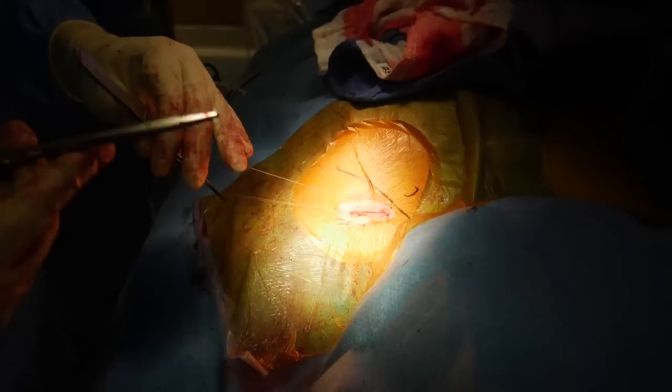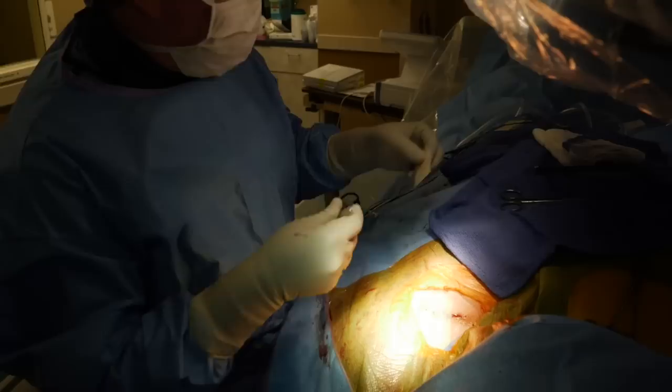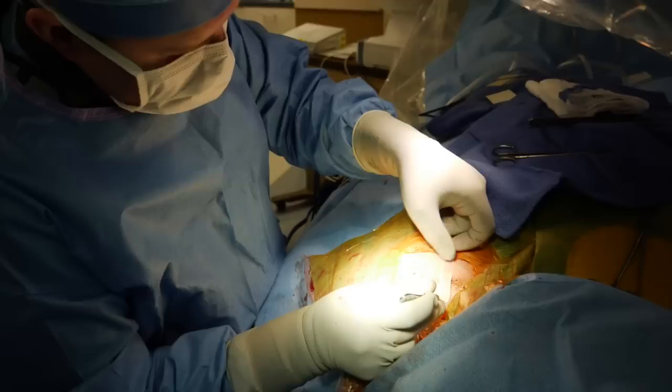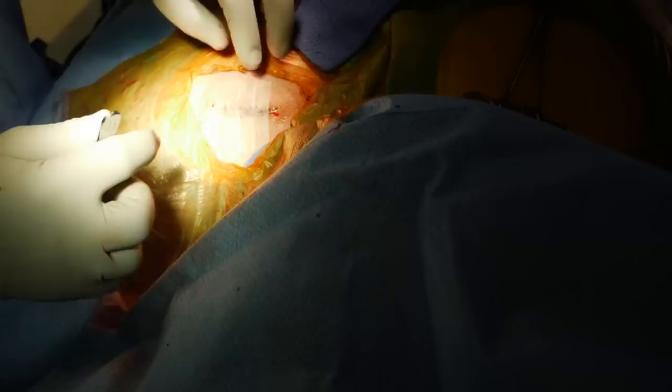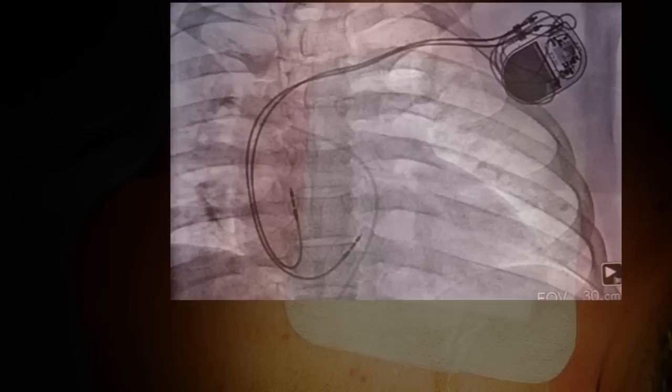Here we are placing Steri-Strips over the incision site that we have sutured shut — these are the final bandages. We'll ask the patient to keep those dry for the next seven to ten days until we see them in the device clinic, and we will be the ones to peel off those strip bandages. They add as much structural integrity as the final layer of suture. We then peel all the dressings away and put the final dressing over top of our Steri-Strips. Typically we'll keep the patient one night overnight, with device interrogation and chest x-ray in the morning, then home the same day.